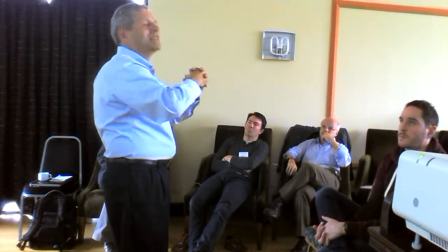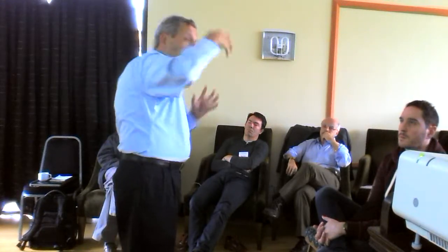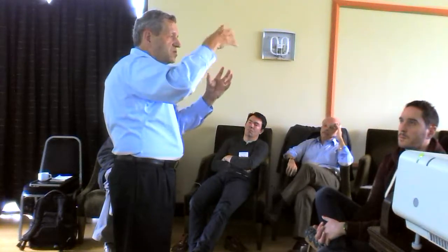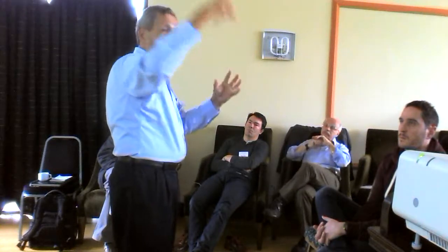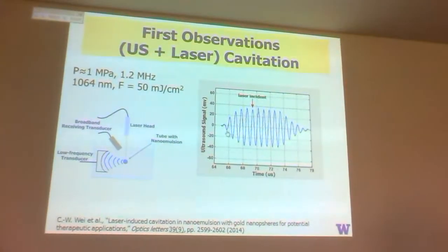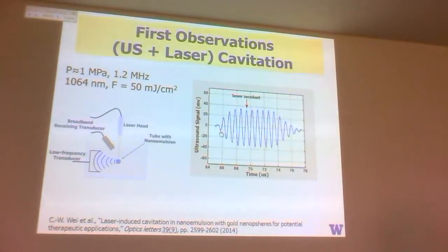On the other phase, exact opposite. You're trying to pull the thing apart because it's a negative pressure, and the little light pulse is just enough to take it into that phase transition in the oscillating state. And that's why you see the wiggles going over there. And this is the other point, is why it goes back and forth. It's totally reproducible.